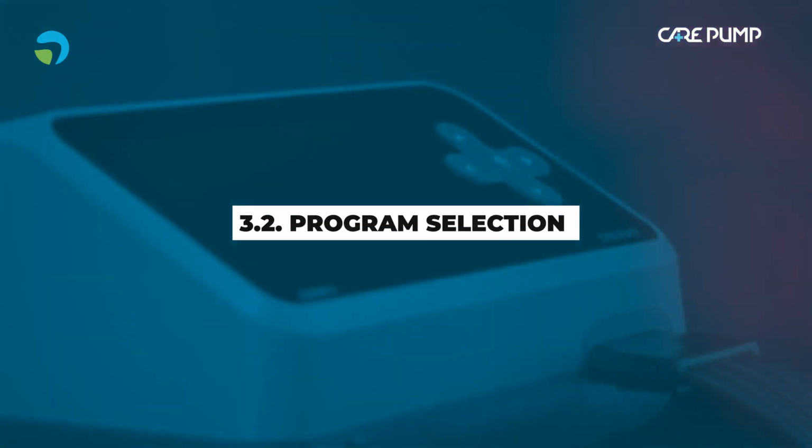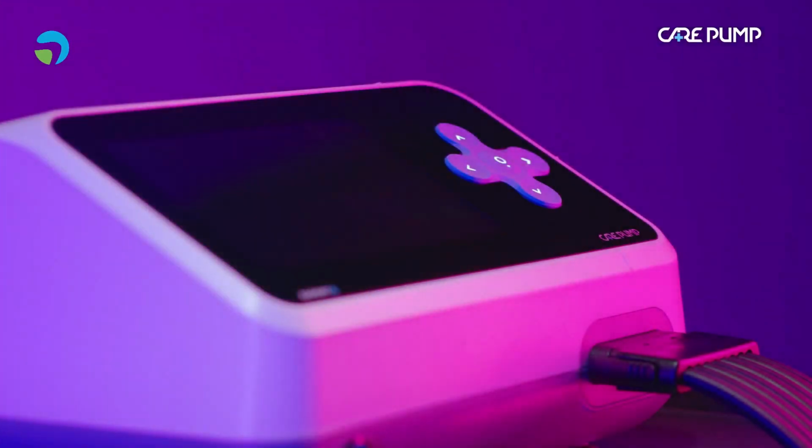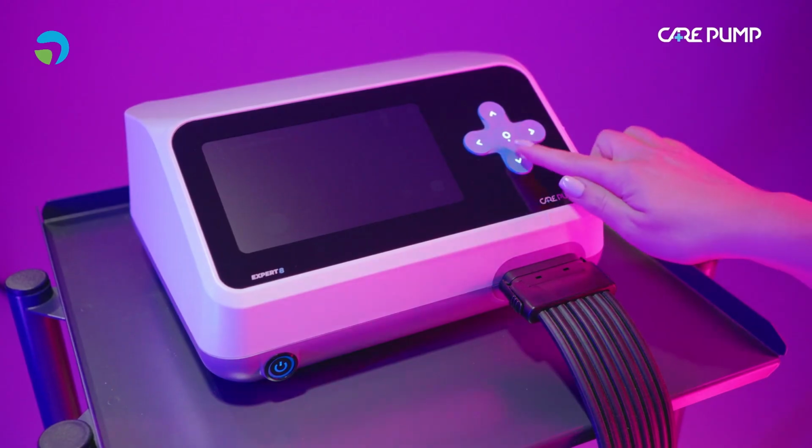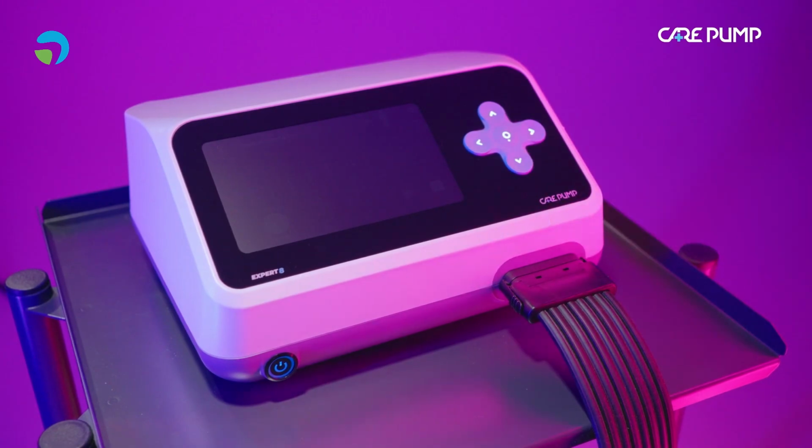Program selection. Starting the treatment using the keyboard is accompanied by voice communicates. Use the up and down directional arrows to select a treatment program from the list. Define program 1. Lymphedema 1. Define program 2. Lymphedema 2. Define program 3. Lymphedema 3.